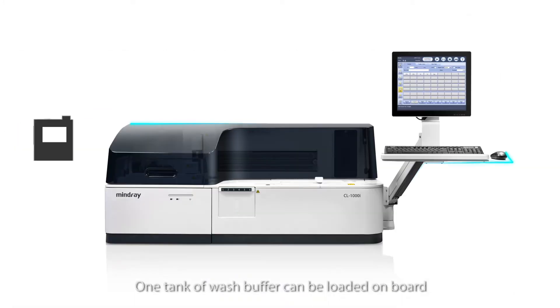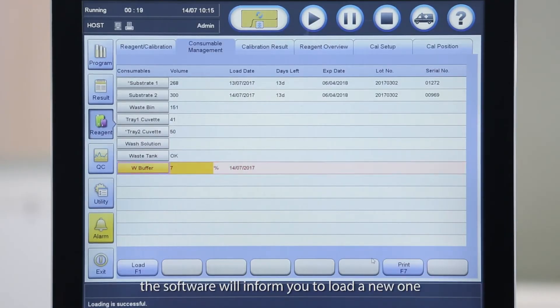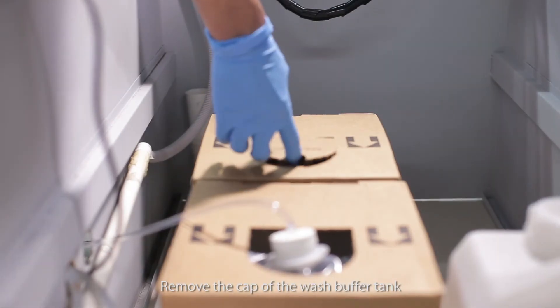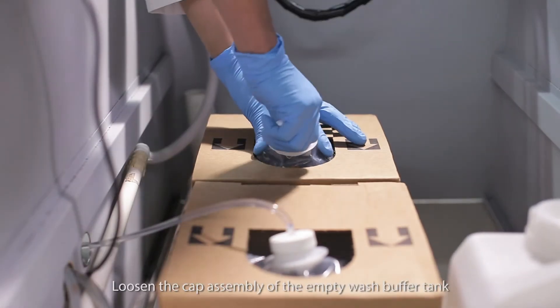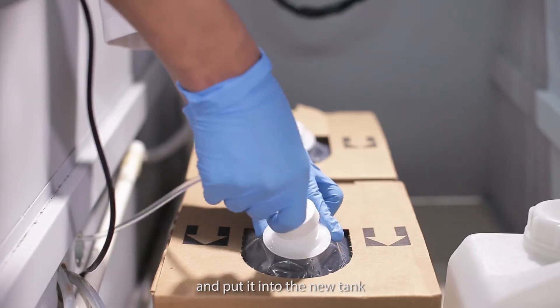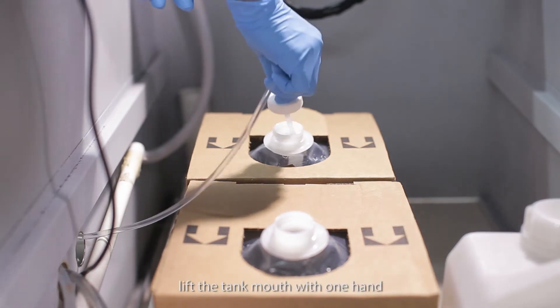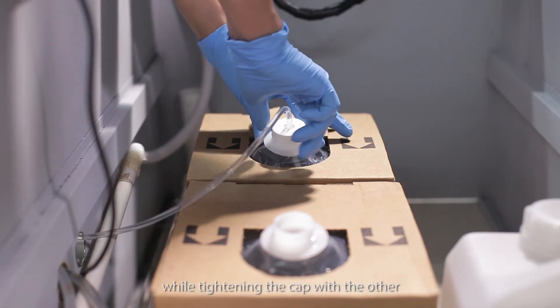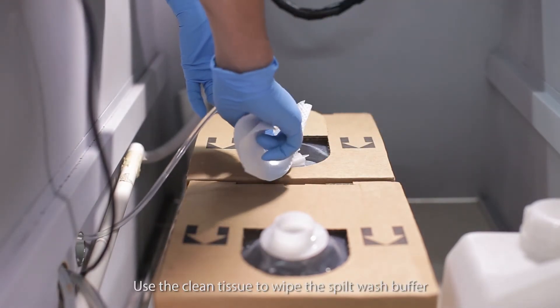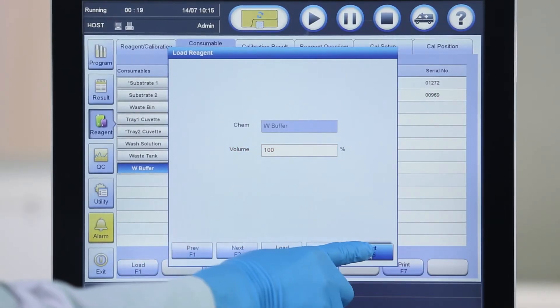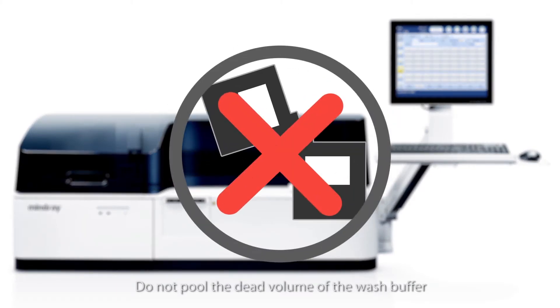One tank of wash buffer can be loaded on board. When it is finished, the software will inform you to load a new one. You can do this when the analyzer is running. Go to the consumable management screen. Open the reagent load screen of wash buffer. Remove the cap of the wash buffer tank. Loosen the cap assembly of the empty wash buffer tank and put it into the new tank. Do not contaminate the cap assembly. When installing the cap assembly, lift the tank mouth with one hand while tightening the cap with the other. Use a clean tissue to wipe the spilt wash buffer. Enter the volume information and click load. Do not pool the dead volume of the wash buffer in case of contamination.